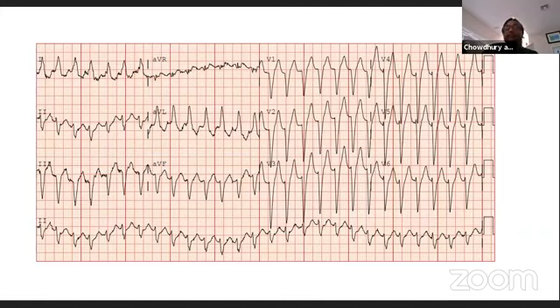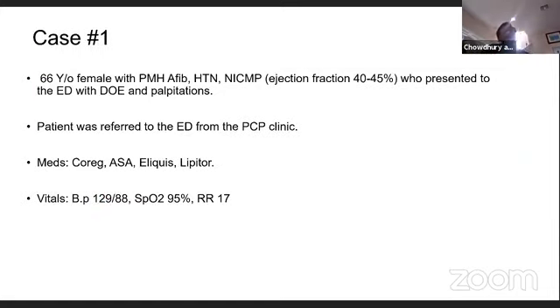And it is tachycardia, right? This is tachycardia. It is wide complex tachycardia. Say that, and then let the big boys take over. So this is wide complex tachycardia. Is it regular or irregular? Regular. I said, okay, it's a regular wide complex tachycardia. And what do you say now?